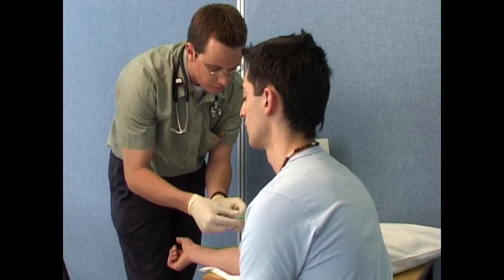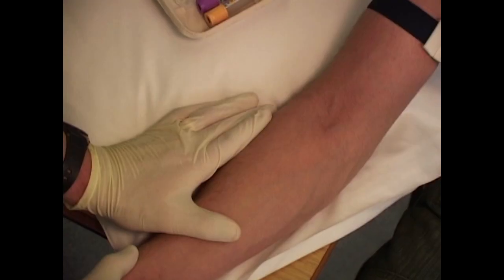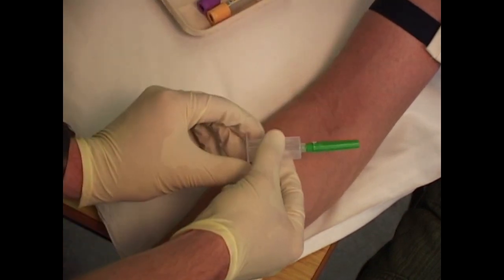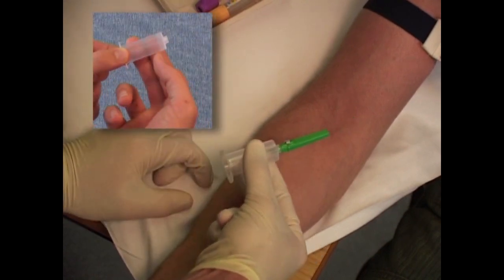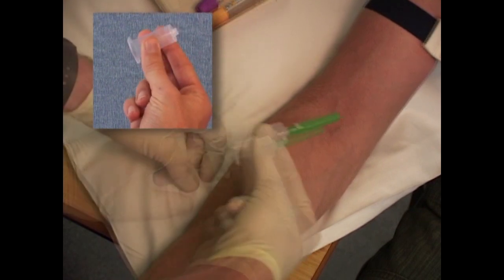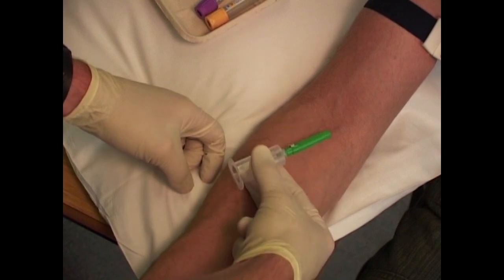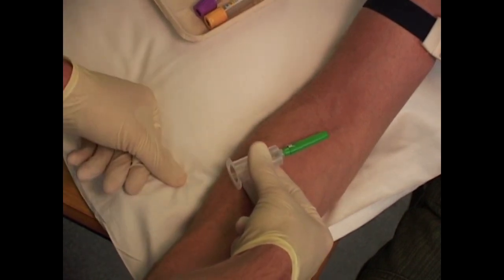Position yourself over the patient so that the identified vein is clearly seen. Use the three finger technique to get a stable grip on the vacutainer assembly. This is done by placing the index and middle finger on one side of the body of the barrel and the thumb on the other side. The index and middle finger will act as a stable yet moveable platform between the patient's arm and the barrel, while the thumb will stabilise the system at the top of the barrel body.